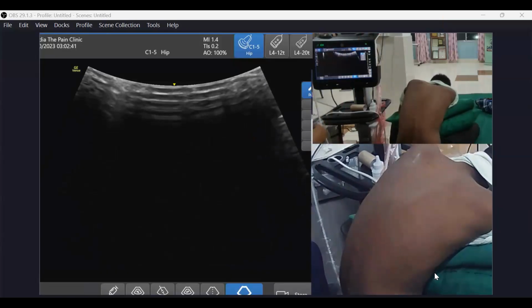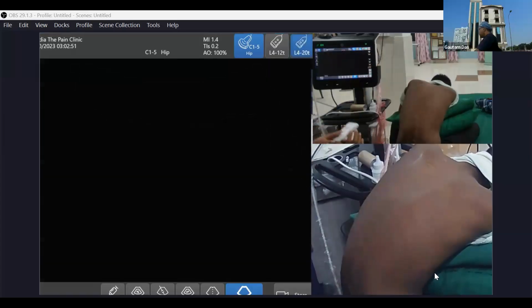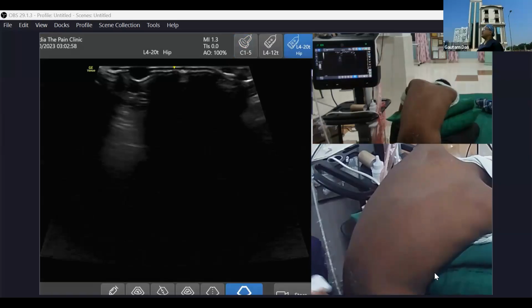Straight, the linear probe. Water for me, please? No, the normal one. Okay, water. Please remain muted when you are not talking, please.